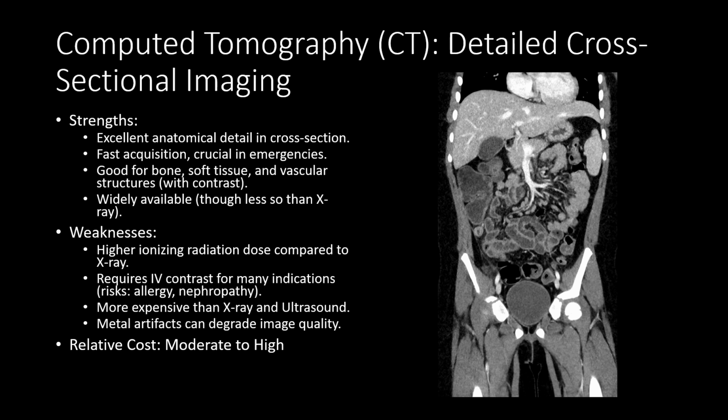One issue that we commonly encounter is artifact from metal. So whether that's an implanted medical device like a pump or a nerve stimulator or a prosthetic joint such as a hip, those can cause a lot of artifact and degrade our image quality. So overall, its relative cost is moderate to high, so certainly substantially higher than X-ray or ultrasound.